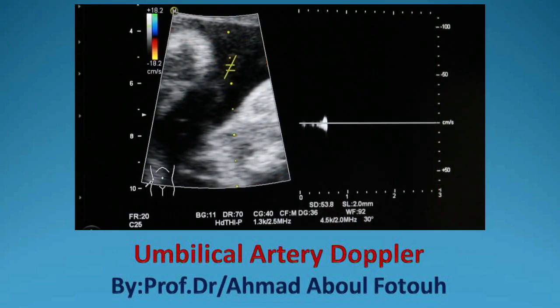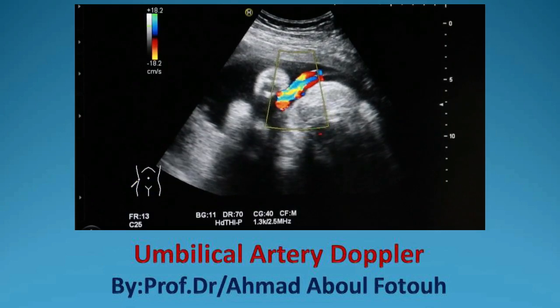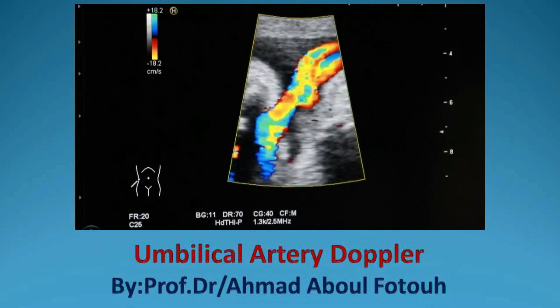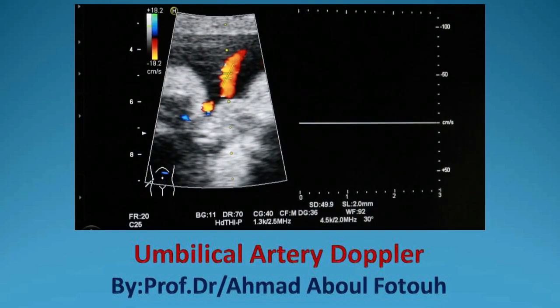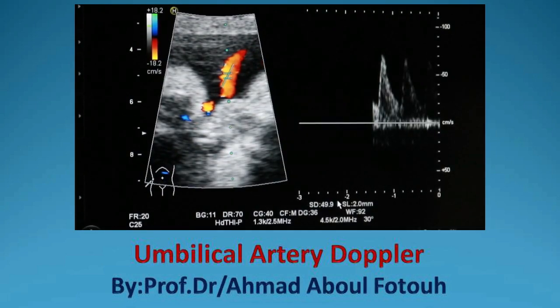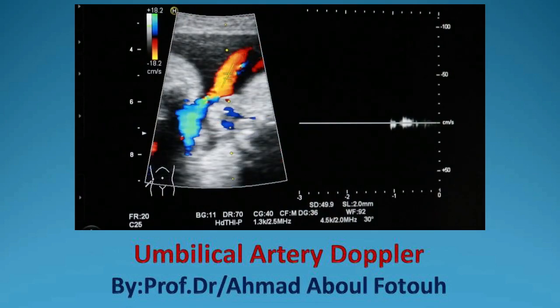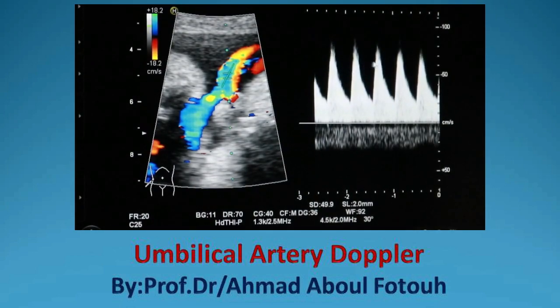This is the way to pick the umbilical artery through the cord at a good, reasonable angle. The key issue is to make a good angle between the incident beam and the portion of the vessel you are measuring, so that you can obtain a very good spectrum. Look at the spectral curve — it is very good.